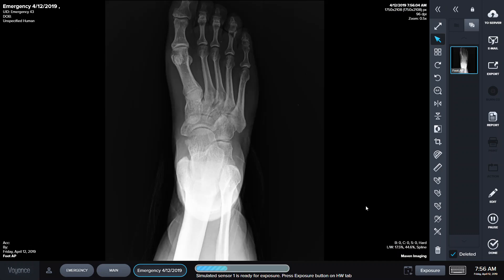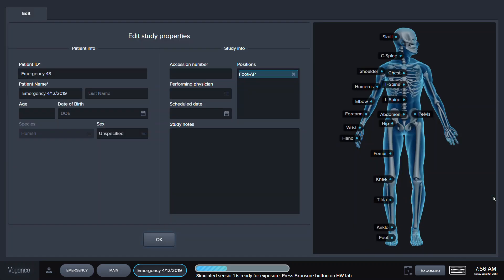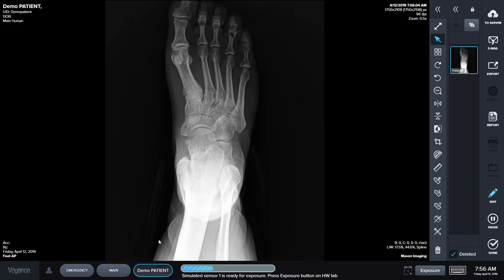Now the patient is ready to be examined. We can go back and process the patient's information. So we can say this is going to be Demo Patient — first name Demo, last name Patient. Click on Sex. Click on OK. And we have created an image and actually changed the information from Emergency to the actual patient's name.